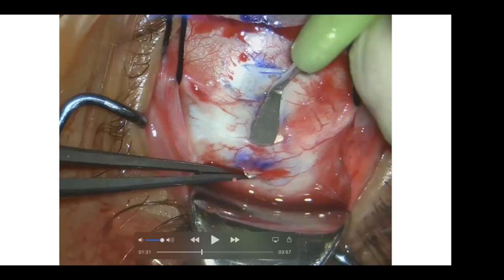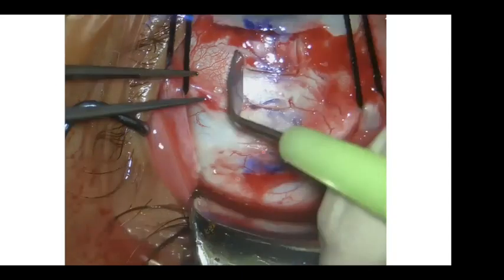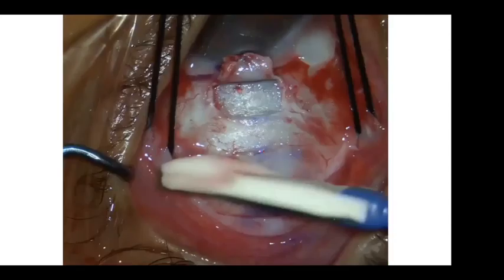And I need a second instrument as counter pressure, so it's a bimanual technique, because if you dissect the tunnel with the crescent, sometimes it keeps dissecting and doesn't come out. You want to make the tunnel 3 millimeters as I'm planning, so I use the second instrument to depress the sclera. While depressing the sclera, this will help the crescent to come out. And again, now the crescent has come out. And then I dissected the rest of the tunnels. And then the third part is a flap. I dissect a flap like that, as after a trabeculectomy.